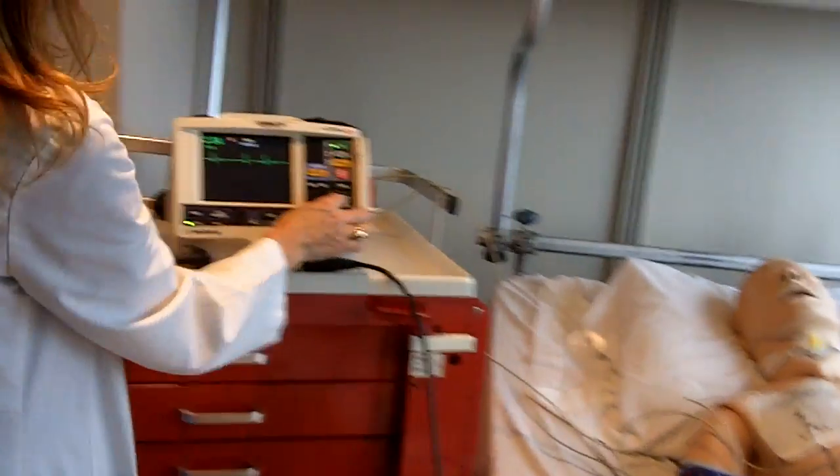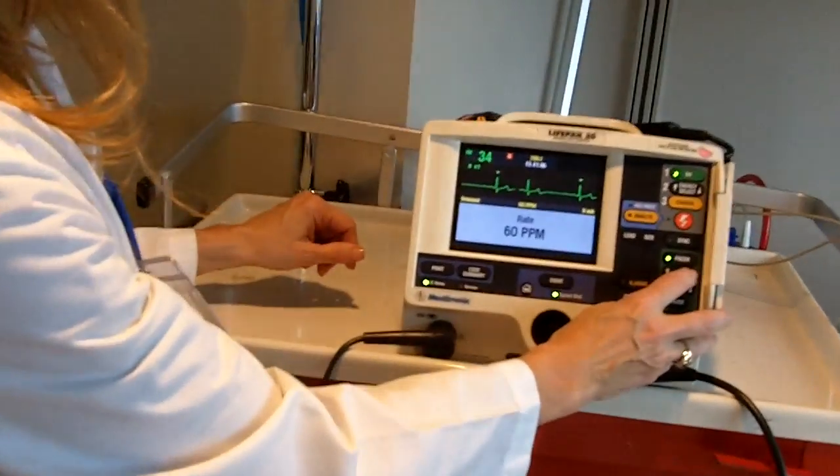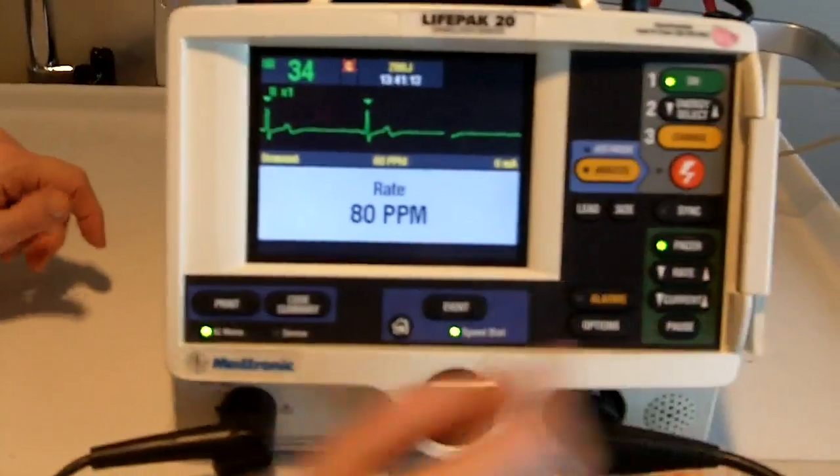I'm going to connect it to my pacing generator and select the pacer mode. I now want to dial in what rate I want it set at — I can choose from 30 to 180 pulses per minute. I'm going to select 80.